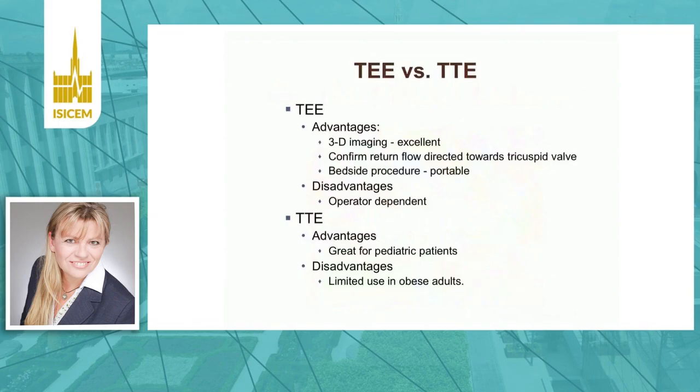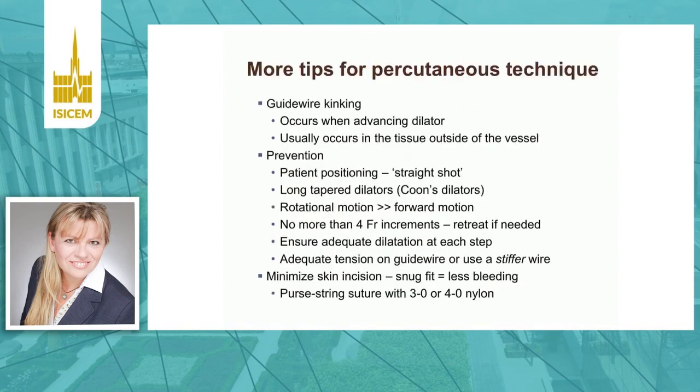About echo, there are some advantages and disadvantages of transthoracic and transesophageal echography, and differences. And there are some centers that use both in parallel. It also helps to identify the liver vessels and not to push the cannula into the liver veins.